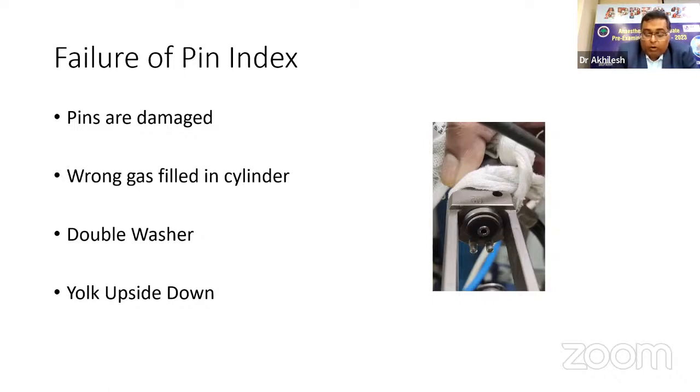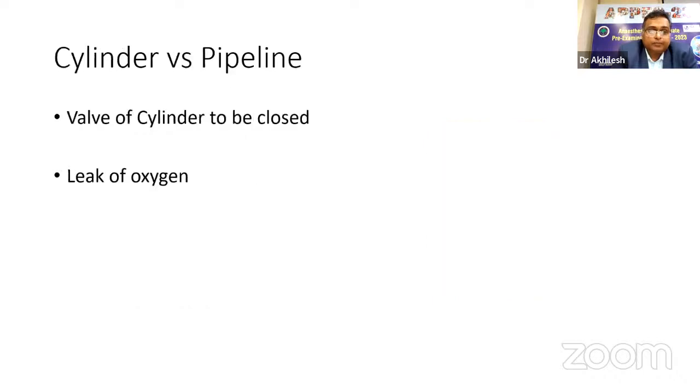So we'll be talking about why this becomes more important and why we have other safety features, like the oxygen analyzer. When we talk about checking of the machine, they become important because there have been casualties where the pin index system was bypassed. And alternatively, there were not many casualties in the same hospital. So another thing which is usually asked, I'll talk about it.